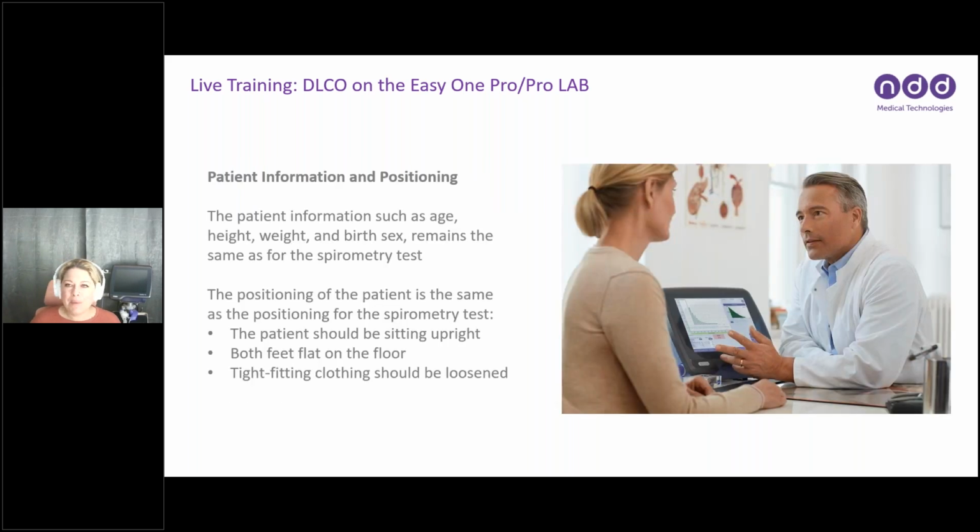All right, so how do we prepare our patients for DLCO? Most of the time, they're not coming in just for a DLCO test. A lot of times there are other laboratory tests, spirometry that needs to be performed, maybe even a multiple breath washout if you have the Pro Lab, maybe you're using a body box, whatever that looks like. A lot of times DLCO is not the only test this patient is doing.